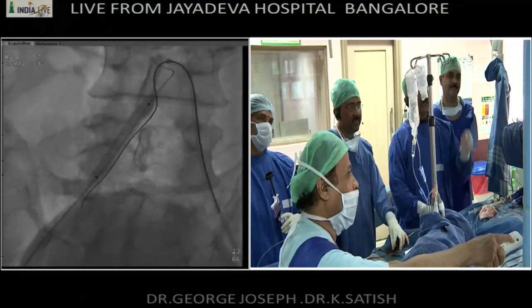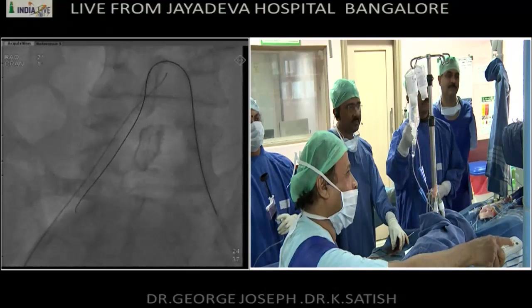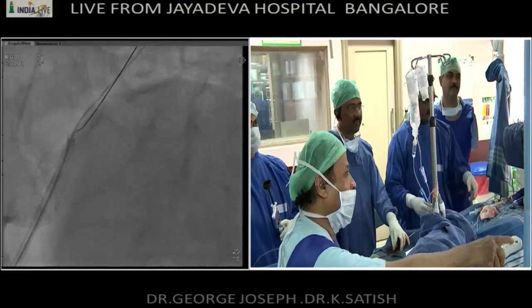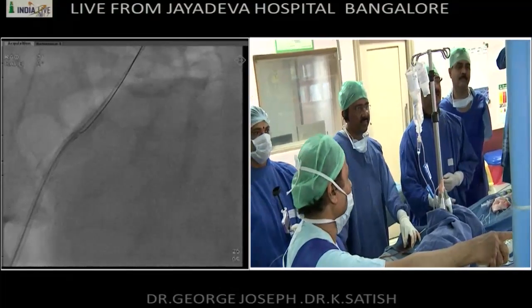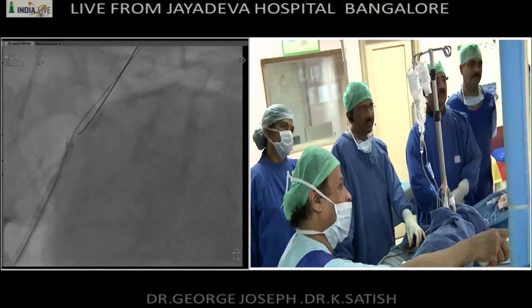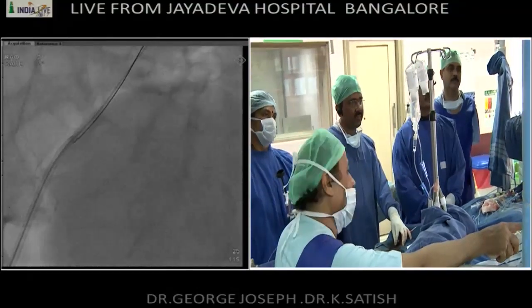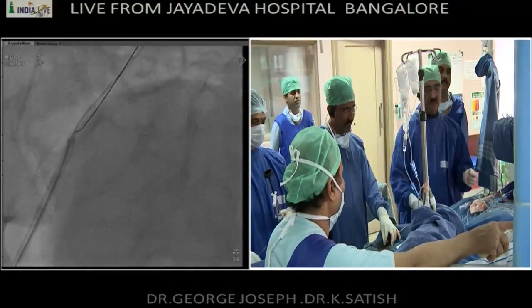Then I pulled the 018 wire back a little bit and advanced it some more. And from the retrograde side, I brought a 7F guiding catheter, and then I rendezvoused it. That means the antegrade wire entered the retrograde 7F guiding catheter. So it has gone into that, and that is where we are now.